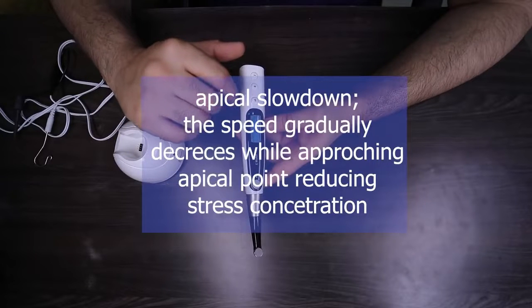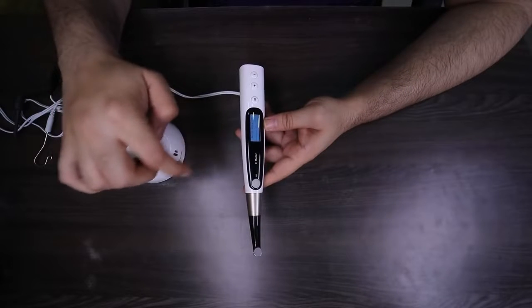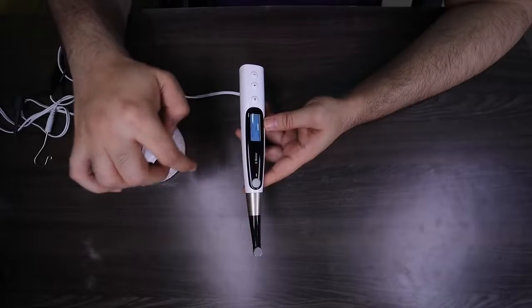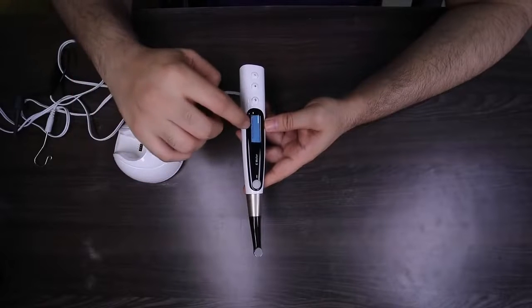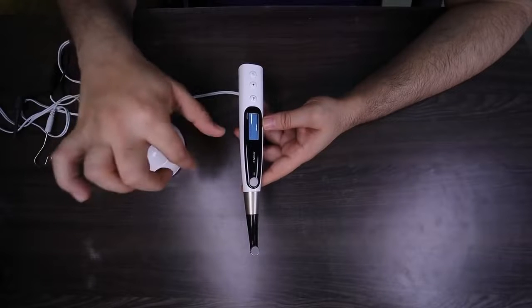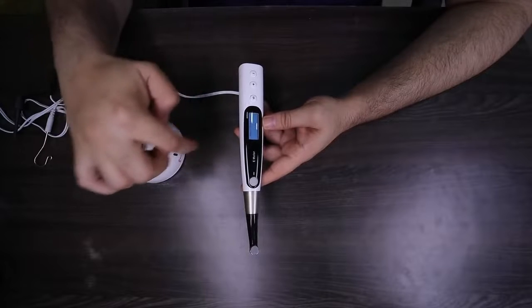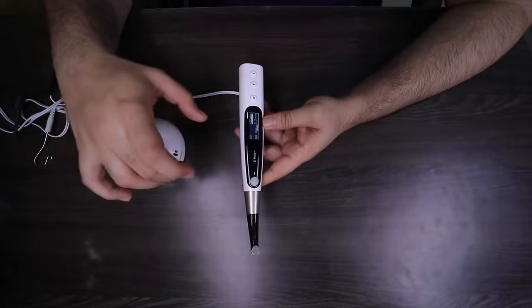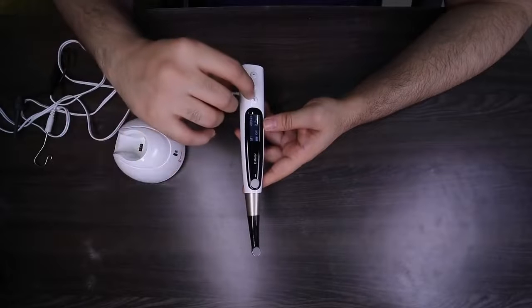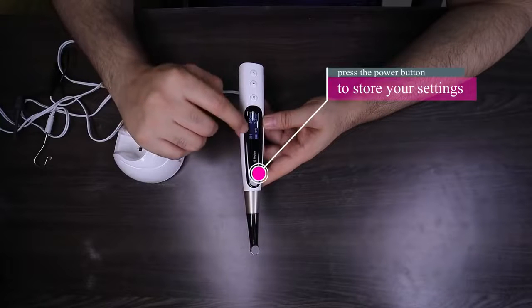Apical slowdown is another brilliant feature incorporated in this machine. As soon as the file approaches the apex, the file will stop and auto reverse at 100 rpm rather than 400 rpm. If I keep slowdown off, the moment my file binds or engages at the apex, it will auto reverse at 400 rpm. With apical slowdown function, as I approach the apex the file first starts moving very slowly — meaning less stress concentration — and when my file binds, it will reverse at 100 rpm. Once you're done with all your settings, all you do is press the mode button and your memory is saved.